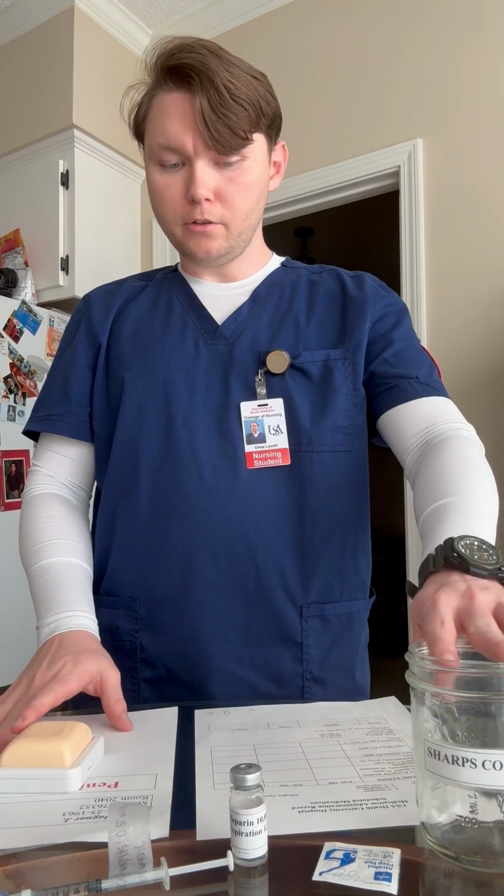Alright, so knock, knock, knock. Hello, Mr. Jones. I'm here to give you your heparin shot. How are you this morning? Good? Okay. So I'm going to raise his bed up, and I'm going to explain to him, hey, Mr. Jones, I've got this heparin for you. We're giving it to you to help prevent blood clots while you're staying at the hospital. And I'm going to be giving it to you in your lower abdomen below your belly button. That's a good region for subcutaneous injections.